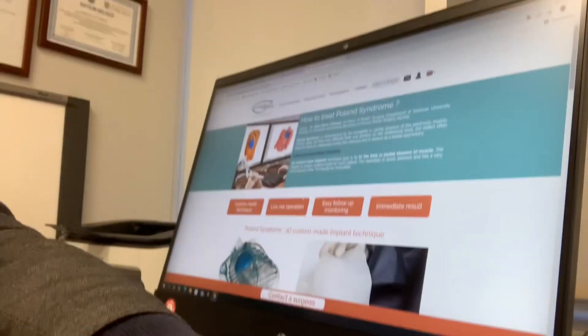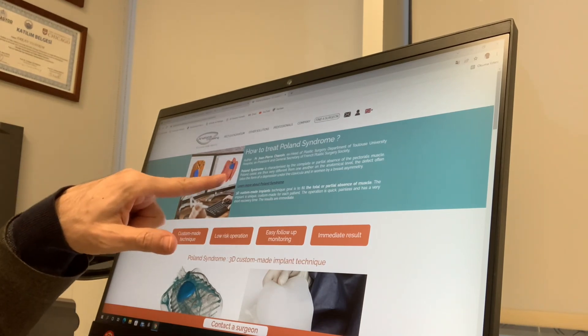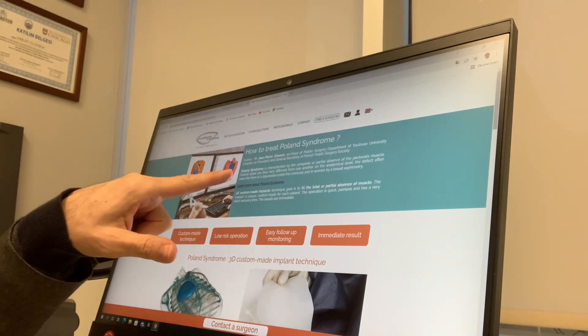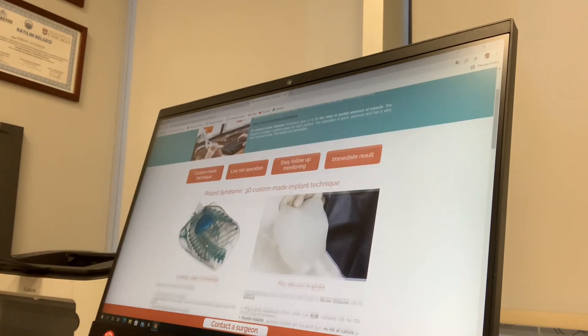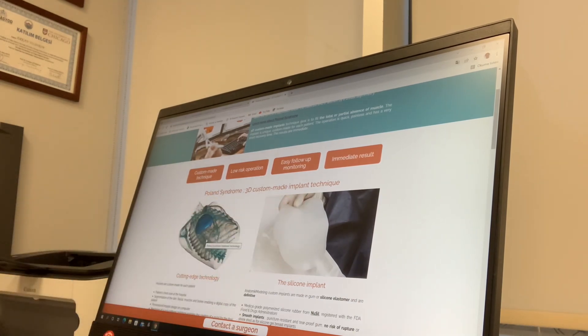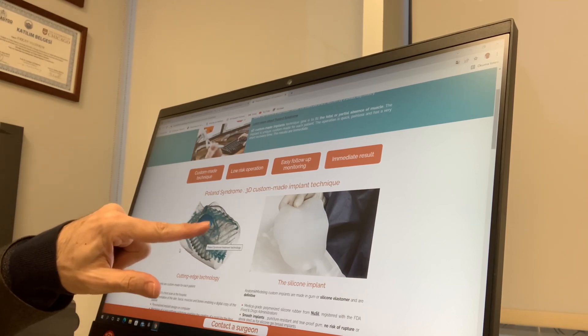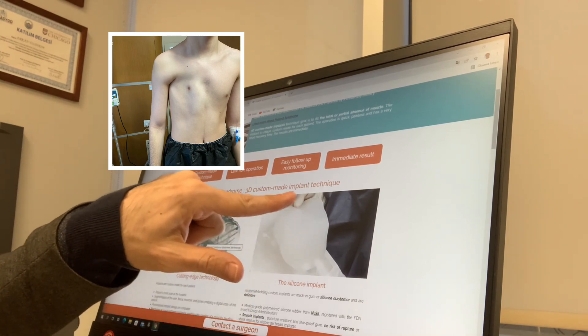Now I'll show it on the screen. Here you can see the missing part. We get 3D images or specialized thin-sliced images. This implant is prepared for every patient separately, so it's called a customized 3D implant. Here you can see the missing part and where we should insert this implant.